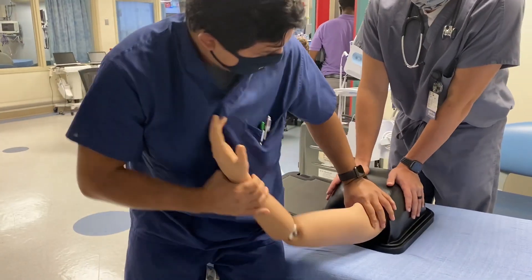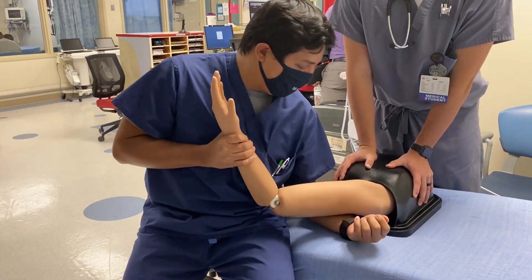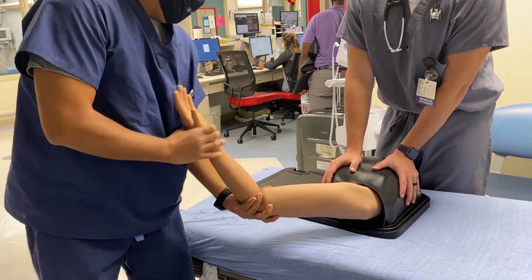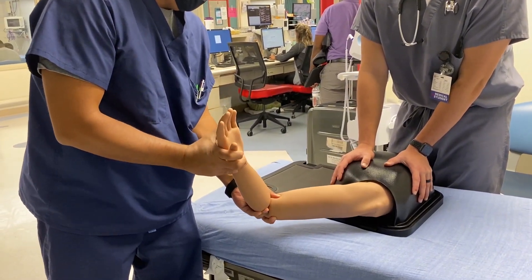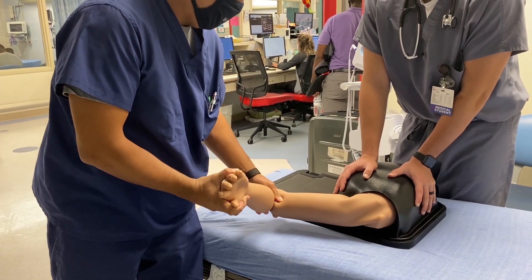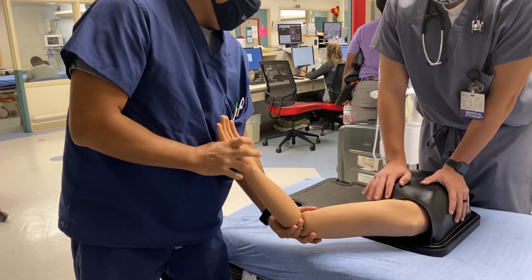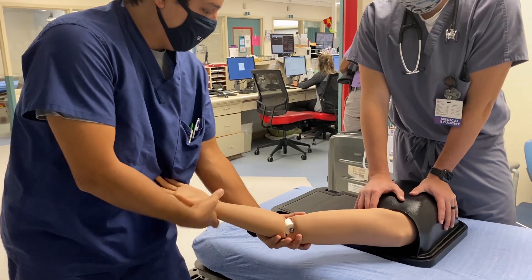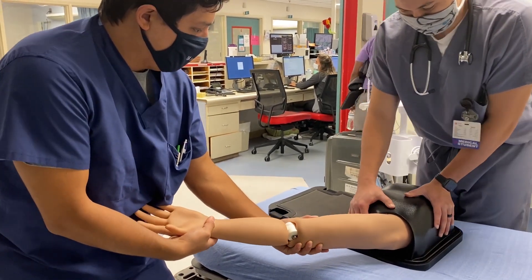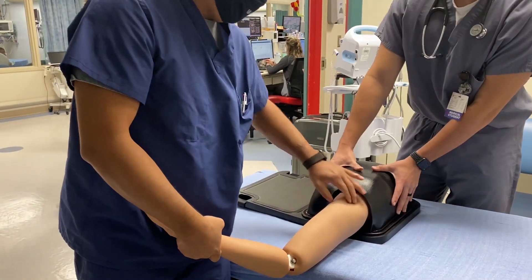Now let's dislocate it again — use your left arm under there. With the arm dislocated, you're going to do external rotation. Adduct a little bit, elbow in. If that's not working, extend the arm completely out, put traction on, and then move it up like the Milch technique — all the way up over the head and it goes in.